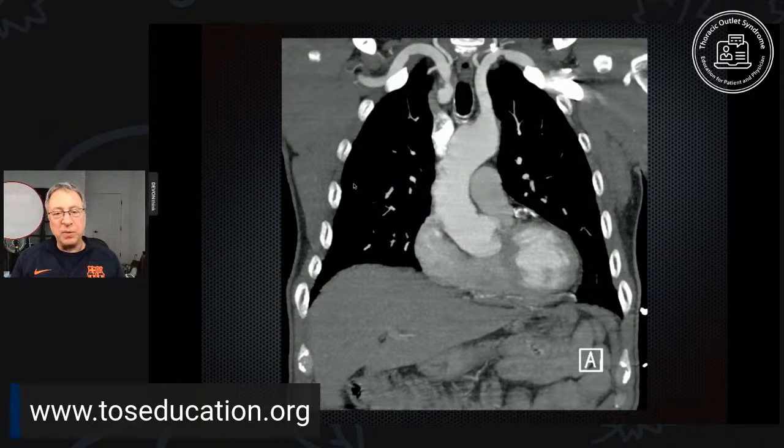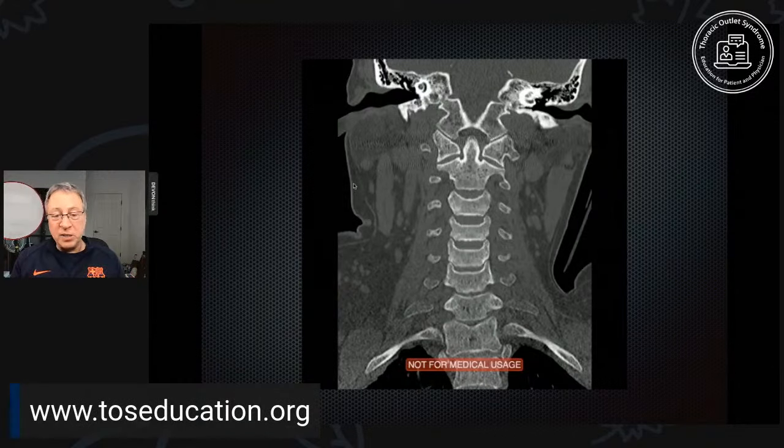And it can show the bones separate from the other soft tissues. You can also take slices and put them together like a jigsaw puzzle and then slice it another way. So we see the bones. This is the cervical spine.